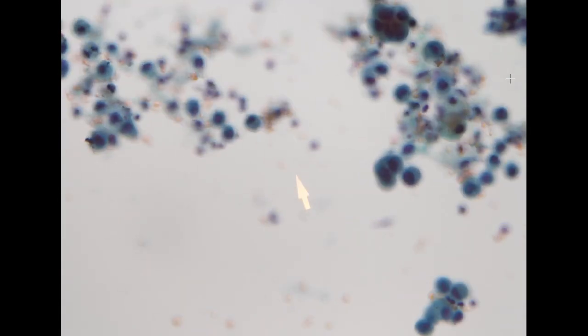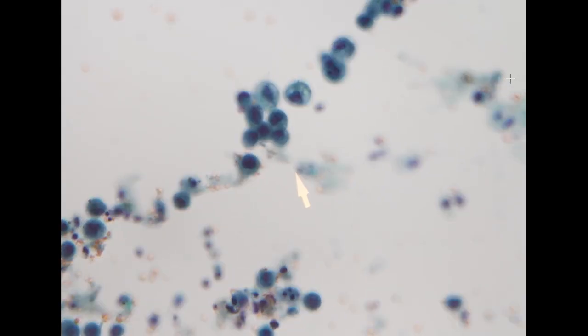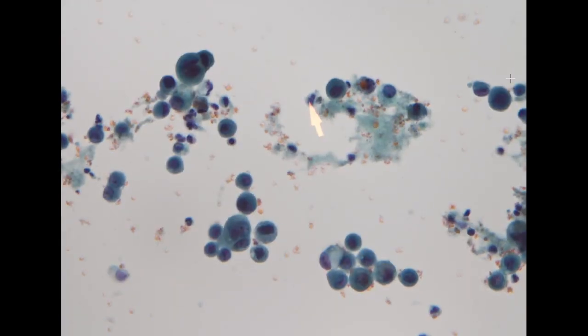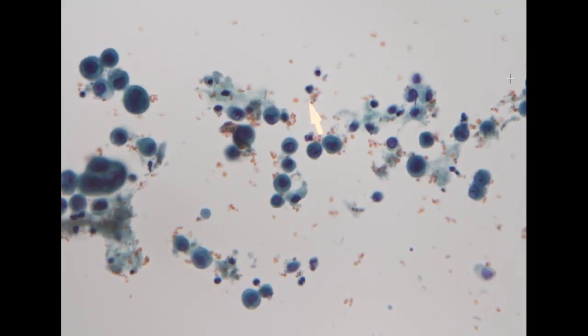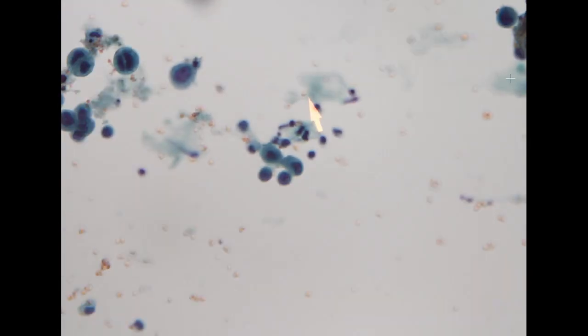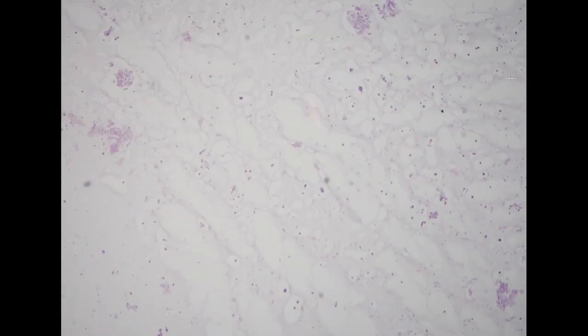Due to this hemorrhagic background, we see a lot of reactive types of changes like vacuolating cytoplasm, enlarged nucleus, sometimes a little bit irregular with small but distinct nucleoli. So it is a little bit difficult to tell if these changes are actually reactive changes or belong to the spectrum of a metastatic adenocarcinoma. We do have a cell block for the specimen.